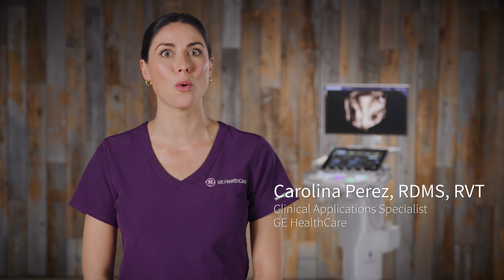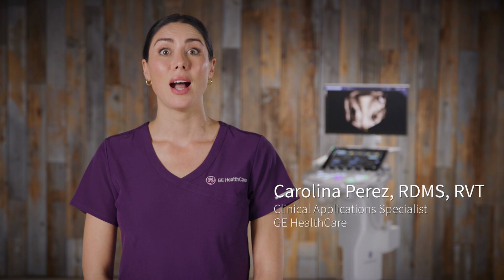Uterine Trace is a game-changing tool to help easily acquire the coronal view of the uterus. I'm going to show you some of my favorite tricks to make it even easier. The first step is always to optimize your 2D image.